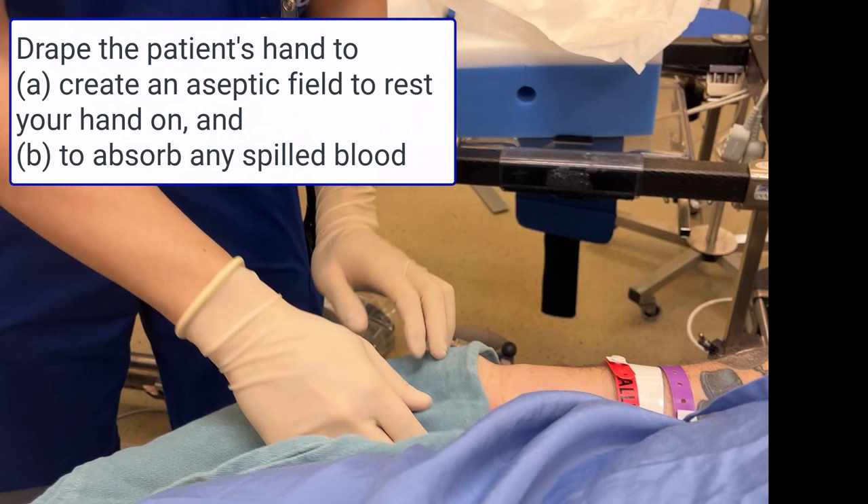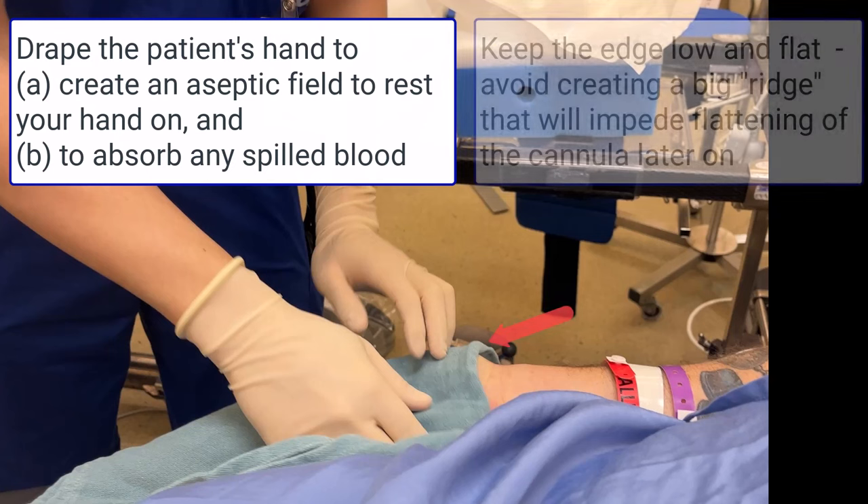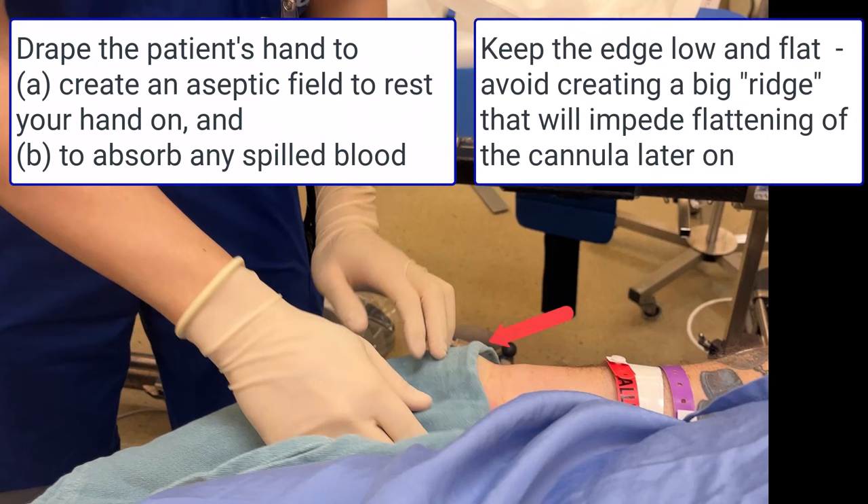Do not drape proximal to the wrist as this is not an area that will be touched. It's important to have the edge of the towel as flat as possible so that it does not impede your ability to flatten the trajectory of the cannula once you've pierced the artery.